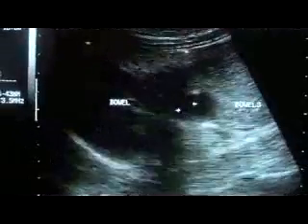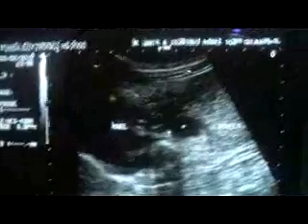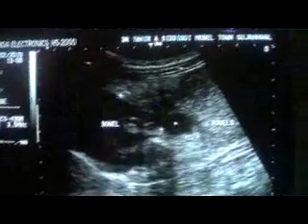And this is the area. This is suggestive of abscess formation and the extension of this fluid material within the adjacent bowel segment. An adjacent lymph node was also seen, and we saw massive peristaltic movements in this case. And so that is definitely suggestive of intestinal obstruction.